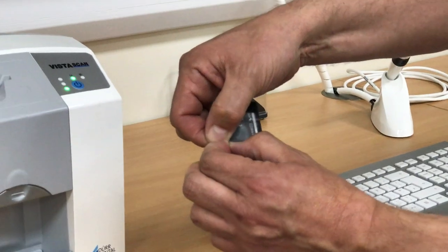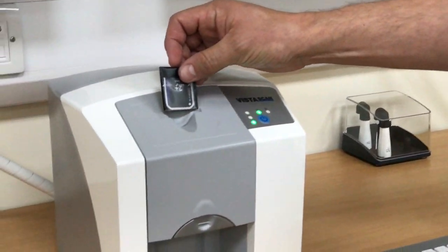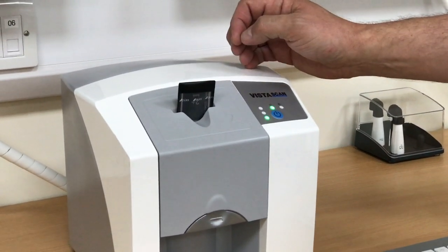Tear open the barrier envelope using the V cutouts at the end and place the torn open edge with the writing of the plate towards you into the scanner.